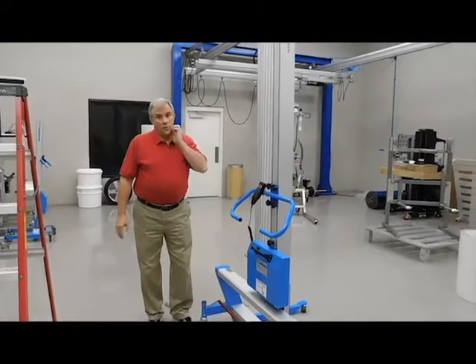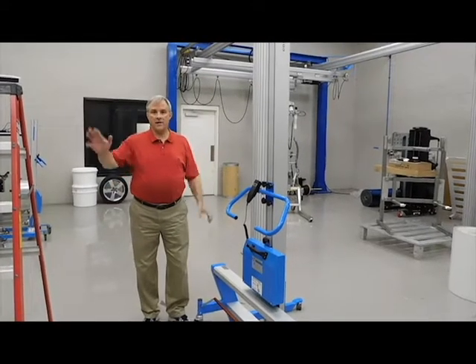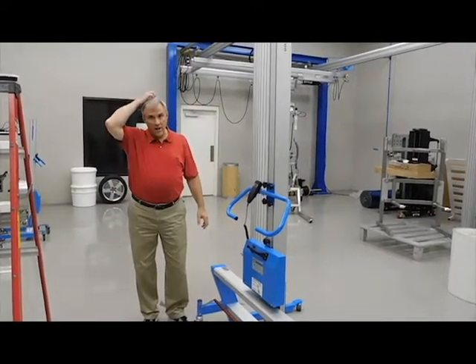Don from R&I, Charlotte, North Carolina. We're going to do a quick video here as to how to change out a lift mast. I've got Craig Morrison, one of our technicians here. We're going to get started.